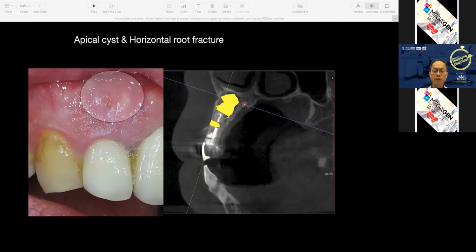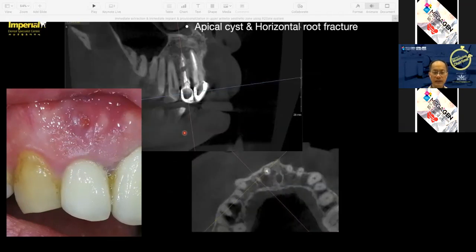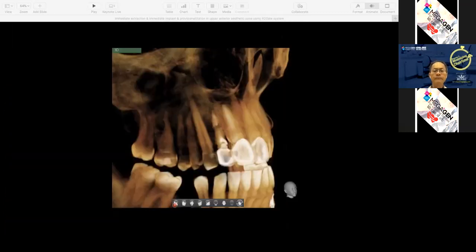Despite repeated root canal retreatment, it has not been able to be identified. If we now look into the 3D from both the coronal view as well as the occlusal view, we obviously see that it developed into a large PA lesion. When we see such a large PA lesion, we need to be very mindful that it is not just pus. It is most likely a granuloma, a periapical granuloma formation. So the significance in terms of placing implants is that having extracted, we need to make sure that we fully enucleate or remove the granuloma, because if we don't do that, that will be one of the causes for implant failure.